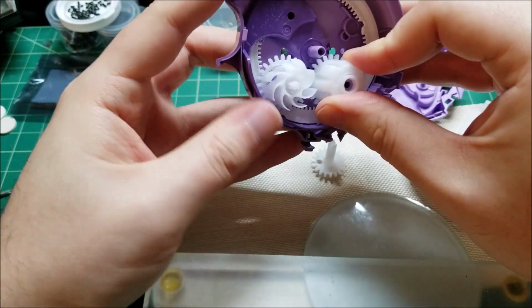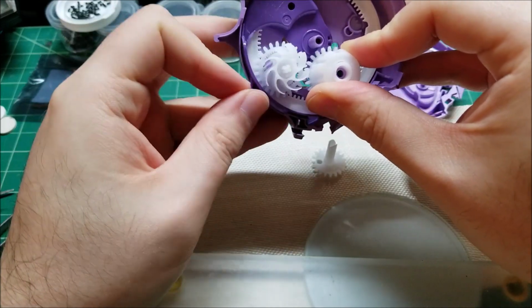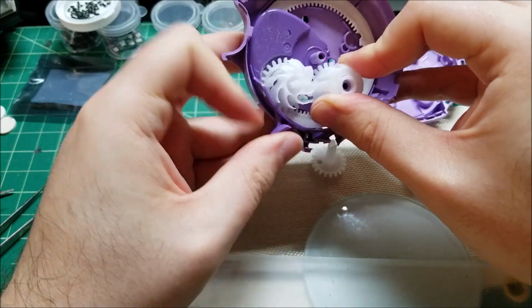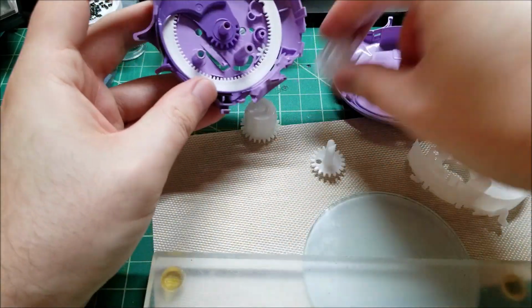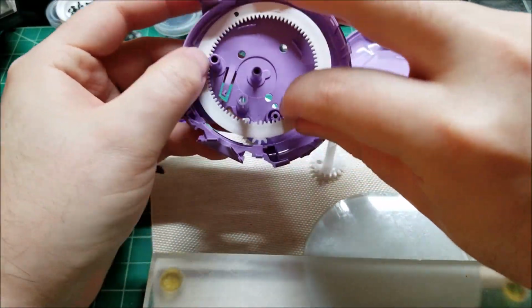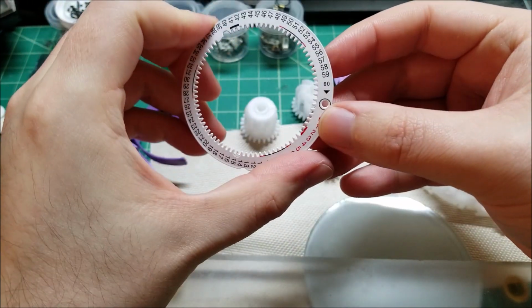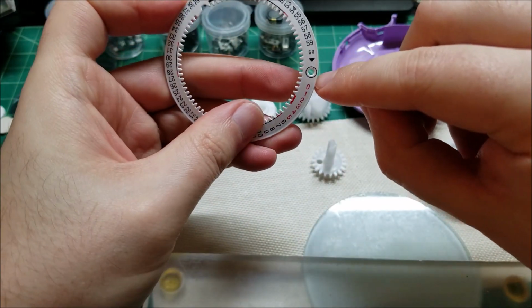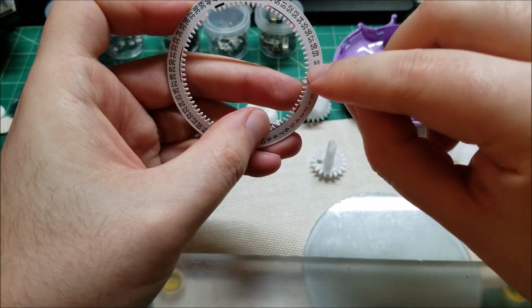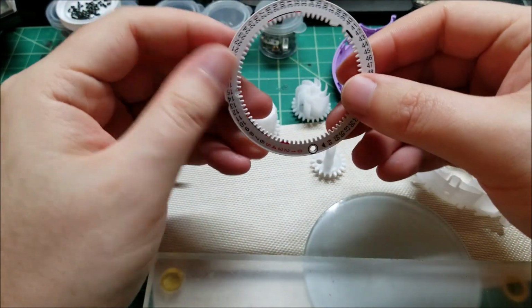Let's see. So yeah, let's see what else. Remove this piece. Man, we just literally have the calendar wheel sort of thing. And yeah, you can see here there's actually 60 doses. So I'm guessing this is how it comes from the factory, kind of preset to this hole or something. Maybe the arrow, and then when you prime it the first time it moves to 60, and then it starts going down as you use it.